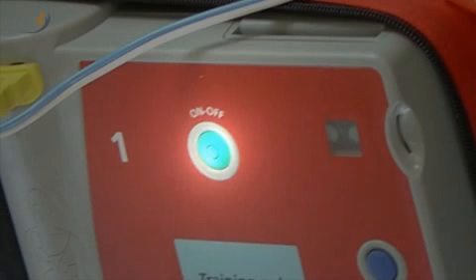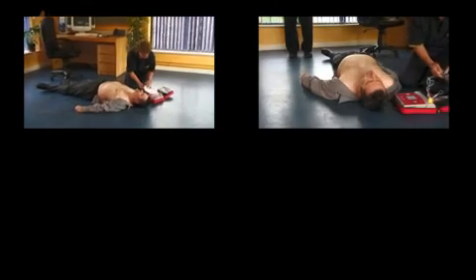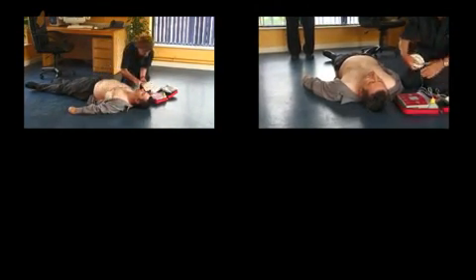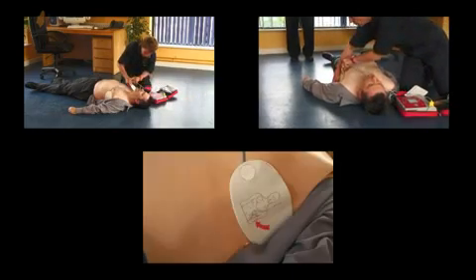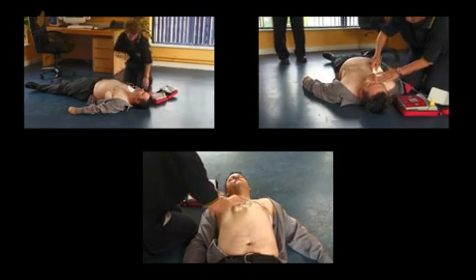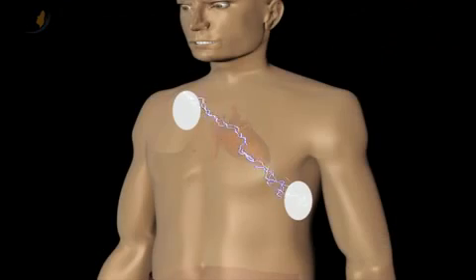Turn on the AED. Place the pads on the patient's bare chest. It is really important that the pads are placed correctly to ensure that the defibrillation energy goes directly through the heart.